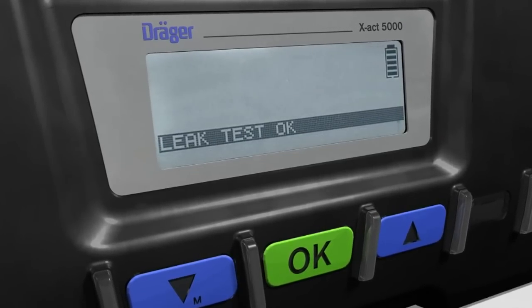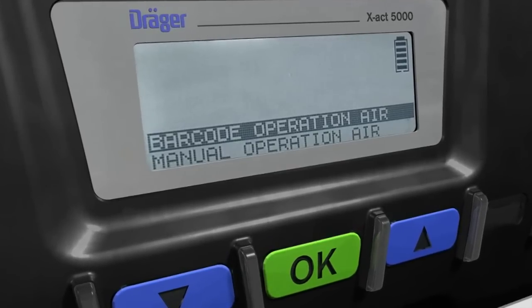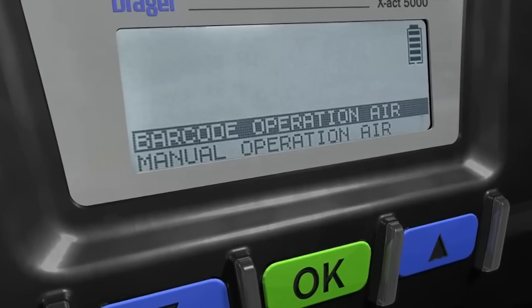Once the test has been successfully completed, the tube pump is ready for use. In the password-protected menu, the leak test can be set as an obligatory test.